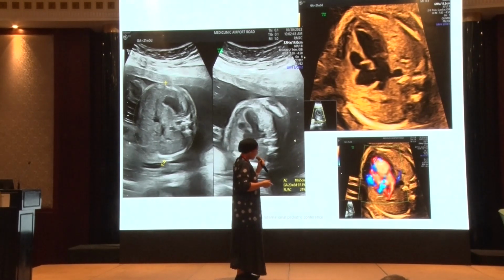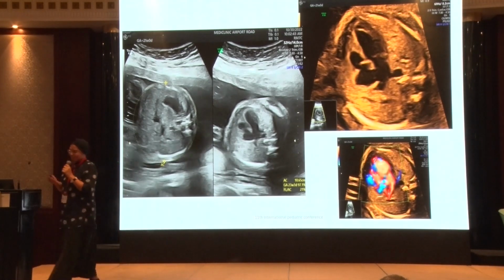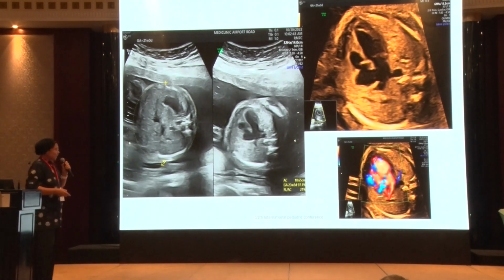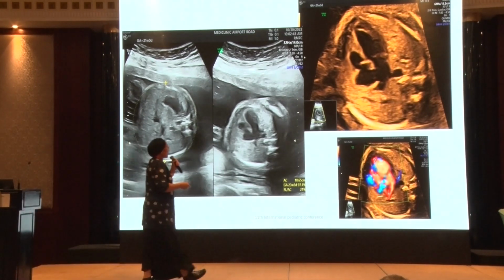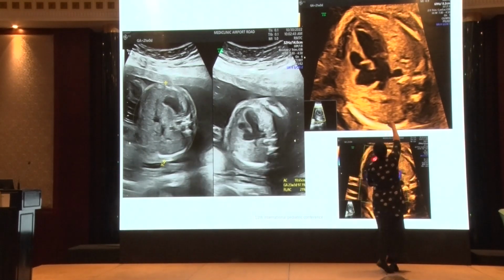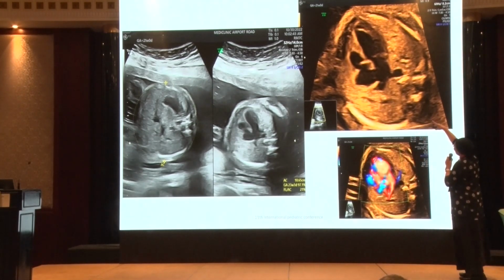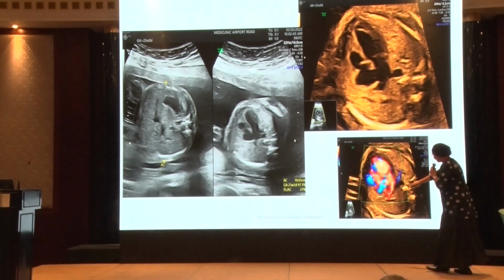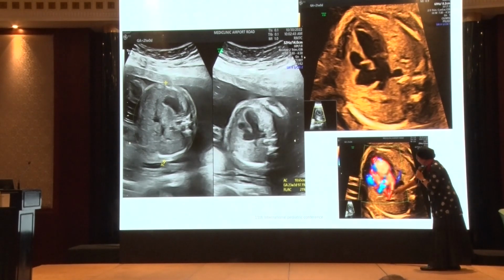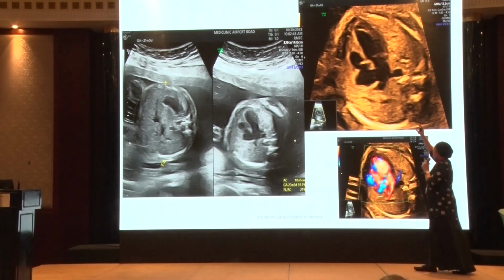Hypoplast. That's a good thing. Thank you so much for saying that. Actually, I put it mainly for the pulmonary arteries, veins. You can see the pulmonary veins that are connected to the left atrium. You can say that it is a little bit prominent, but this is very important.